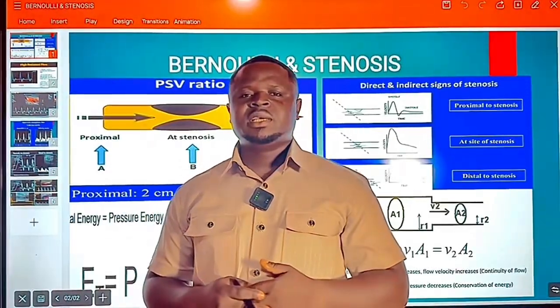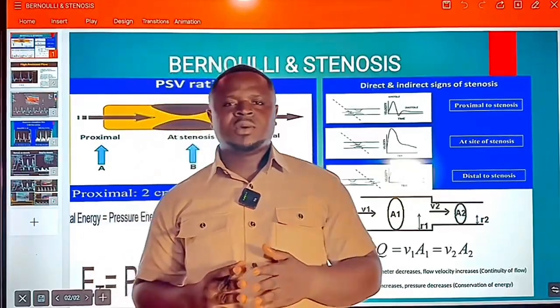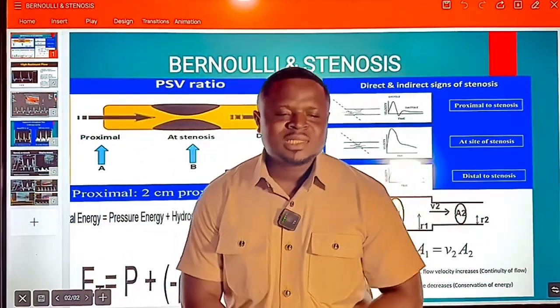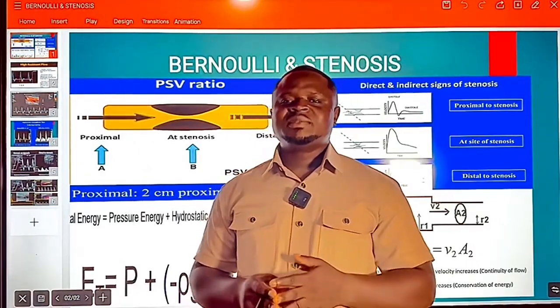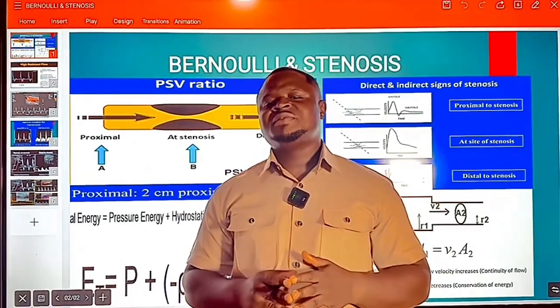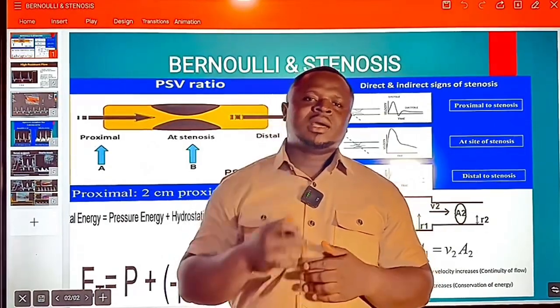I am Nanampofoje, a diagnostic medical sonographer, and today I'll be taking you through vascular ultrasound. Most importantly, the lower extremity arterial Doppler. Sometimes it's quite confusing because most sonographers find it difficult to interpret the waveforms. Now, let's begin.